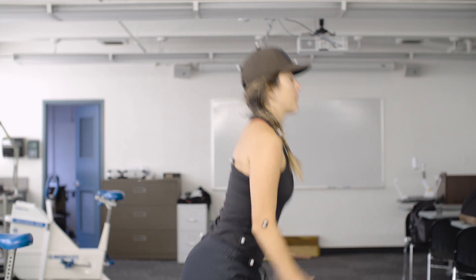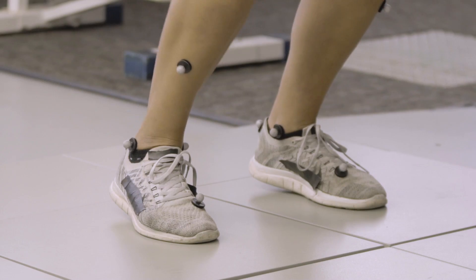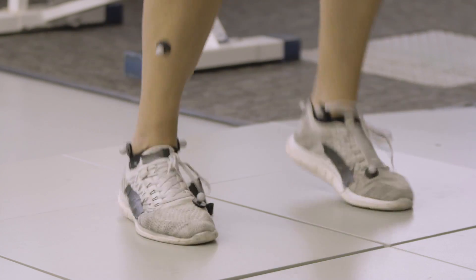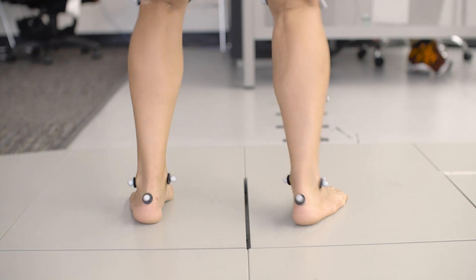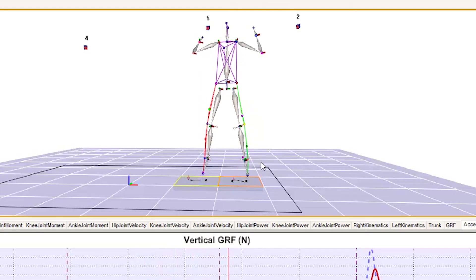Another black-box solution is JumpTrack. JumpTrack analyzes the mechanics of jumping, and this has implications for ACL injuries and other knee-related injuries.